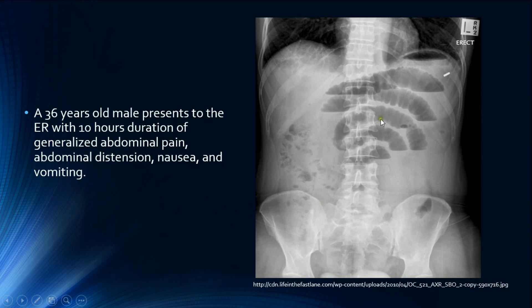Moving to the systematic review, we can see the small bowel is enlarged. We cannot see any gas in the large bowel; however, we can note some fecal material here. There are no signs of pneumoperitoneum such as free air under the diaphragm or the double wall sign, so there are no visible signs of perforation.